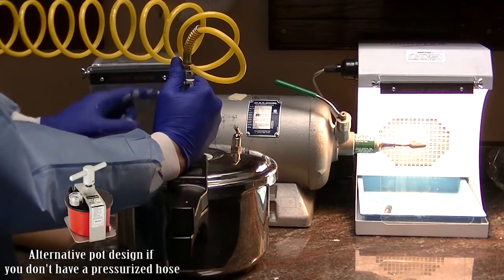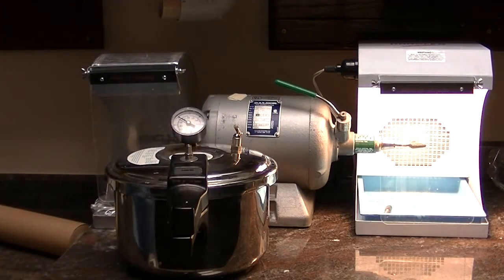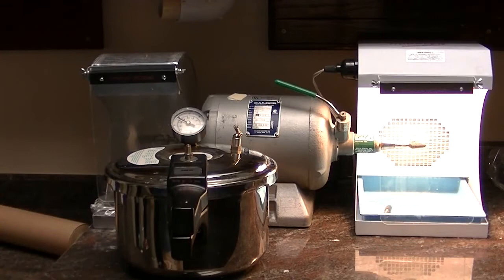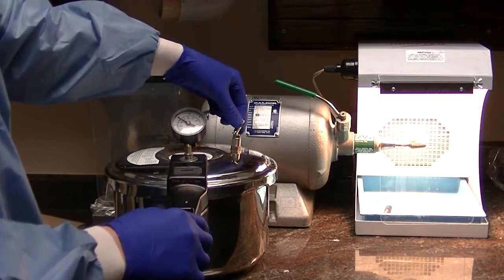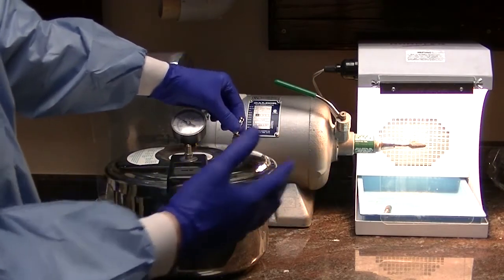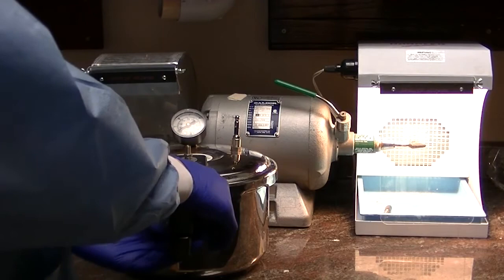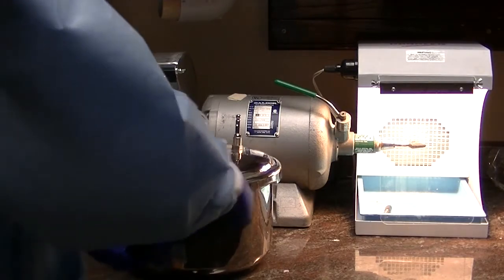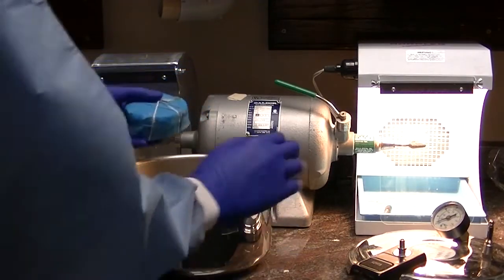which on this pressure pot is the green marker right there. We give this approximately 15 minutes, come back and we'll remove it. After approximately 15 minutes, we can release the air pressure vent hole and remove the lid. Depressurizing the flask and removing our putty material.